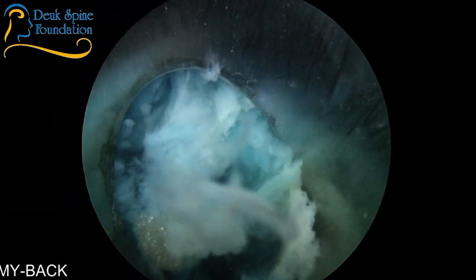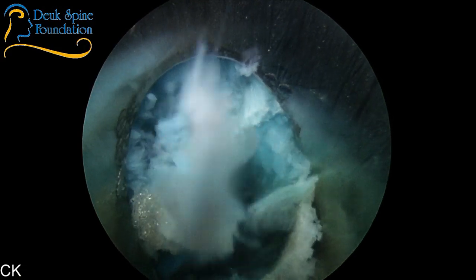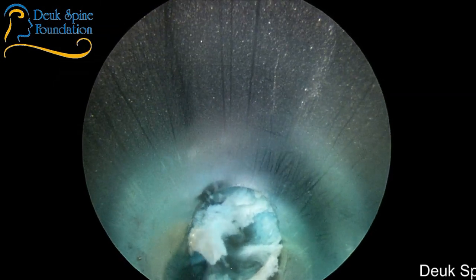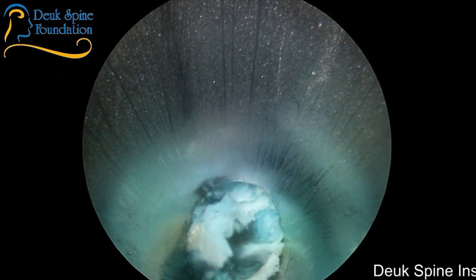All right, so I've taken a lot of the free pieces out. I'm going to free fragments, we call it. I'm going to bring the laser in for our last disc. This is the L5S1. We've already done L3-4 and L4-5.